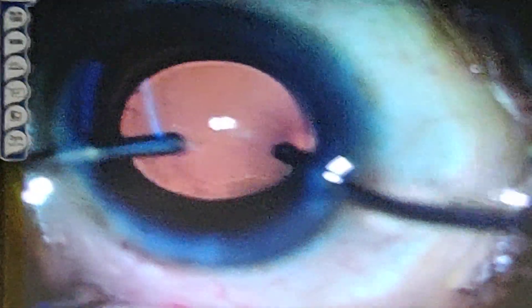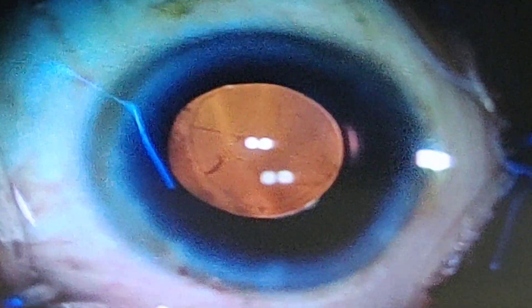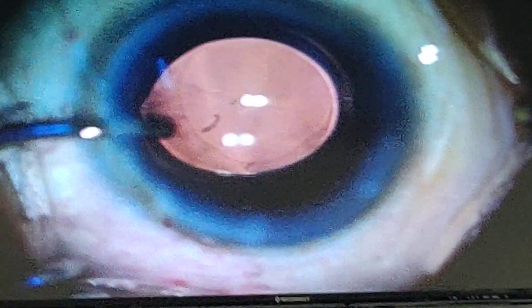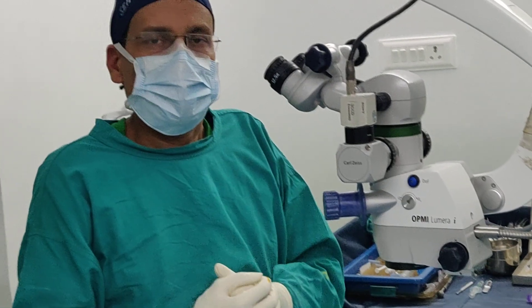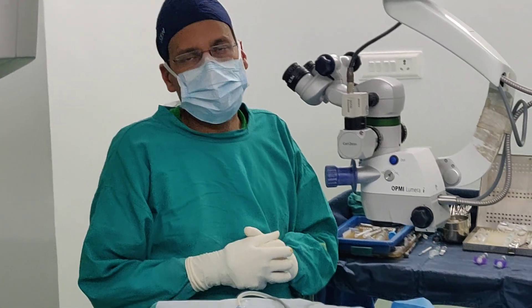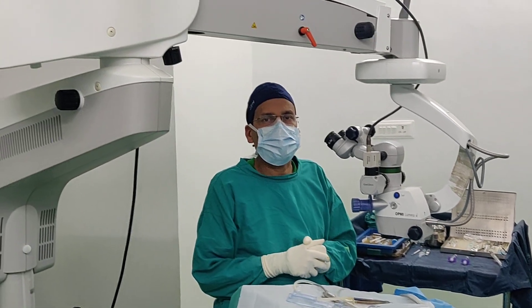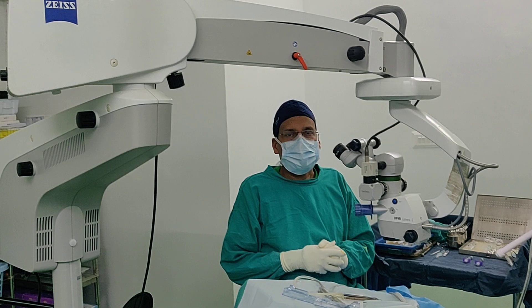The Technis Simplicity Delivery System is a single-use system. It provides a possibility to implant the lens into the capsular bag without any risk of contamination. You have seen the implantation of the Technis one-piece lens with the pre-loaded Simplicity Delivery System. This system has been introduced by Johnson & Johnson recently and is an excellent tool to implant the lens without risk of contamination.